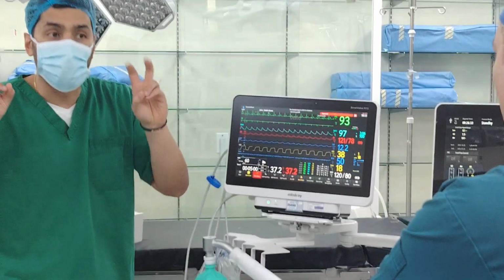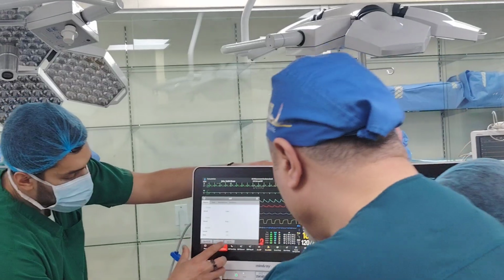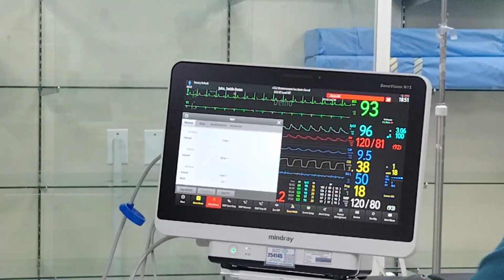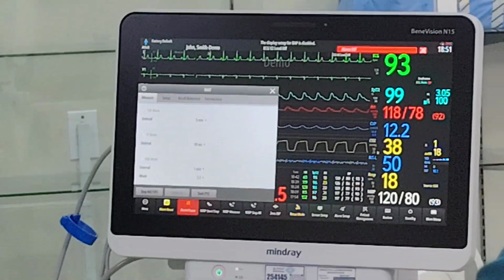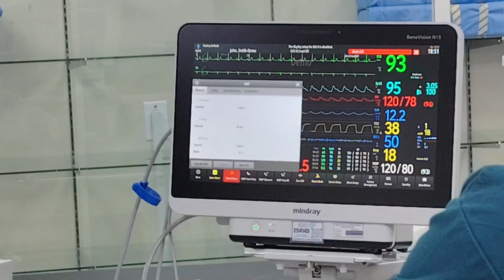Now, in case you want to go a little bit deeper, and you have very complicated surgeries, and you want to look at deep block, you have something called PTC. Sorry, post-tetanic count. Post-tetanic count is 20 pulses. So same concept: TOF is 4 pulses, PTC is 20 pulses. How they usually use it is after TOF goes from 100 to 0, then 4 to 0 in counts. This is medium block level.